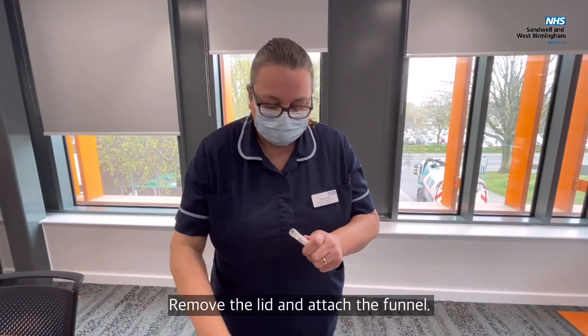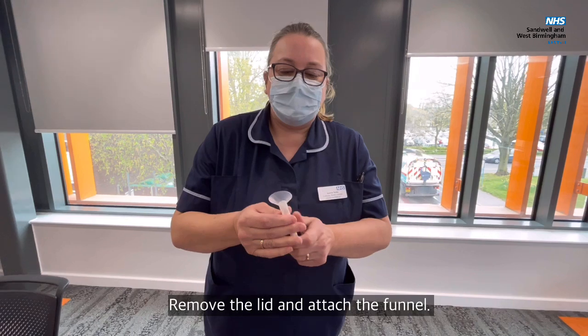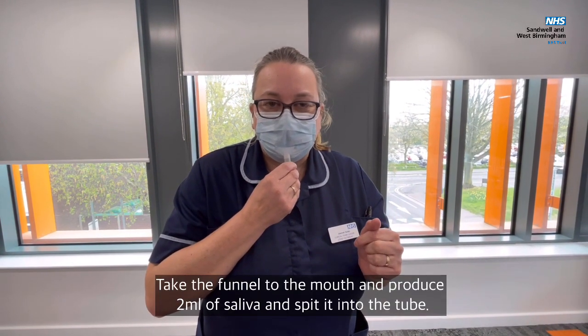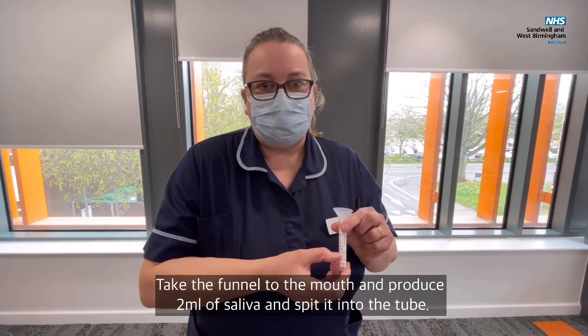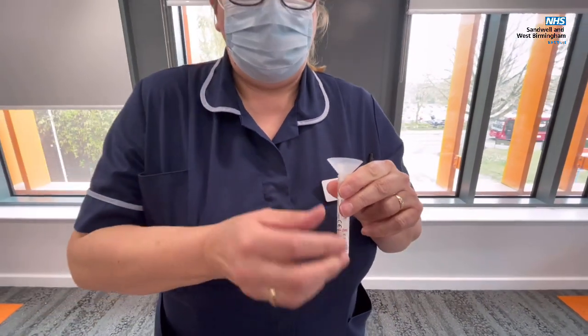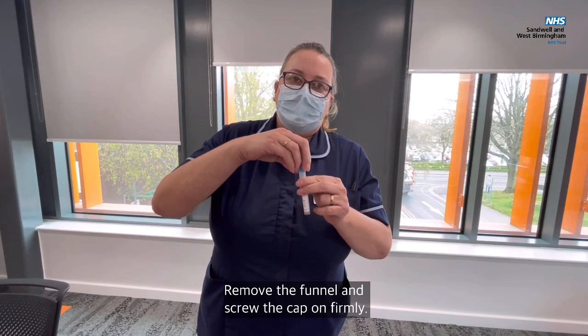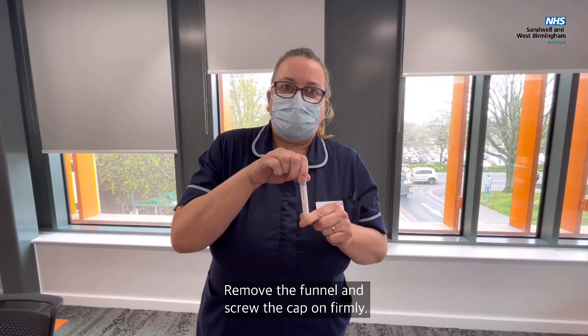We're going to remove the lid and attach the funnel. Take the funnel to the mouth and produce two mils of saliva to that point there. Then remove the funnel and screw the cap on firmly.